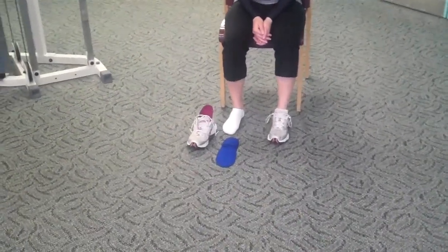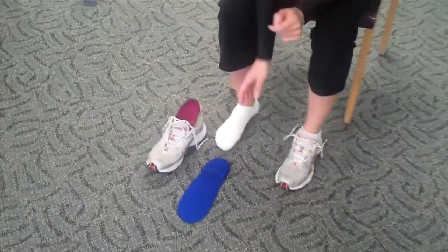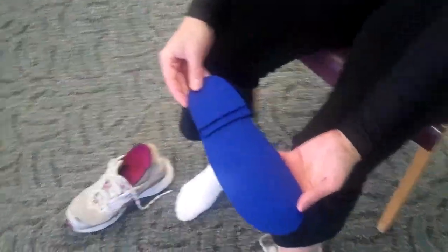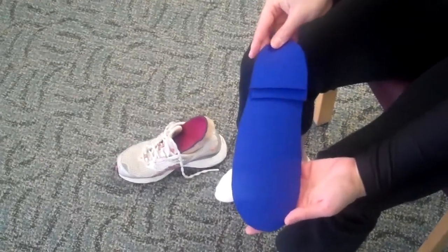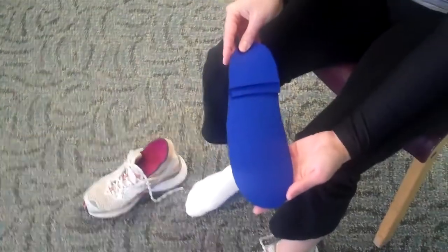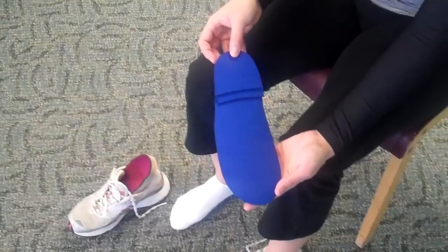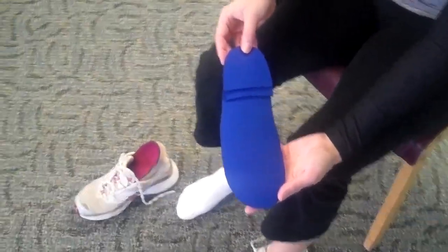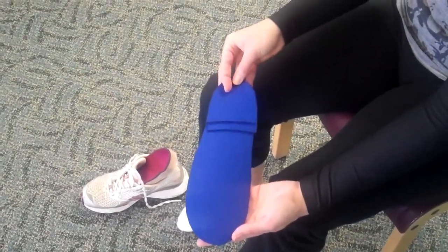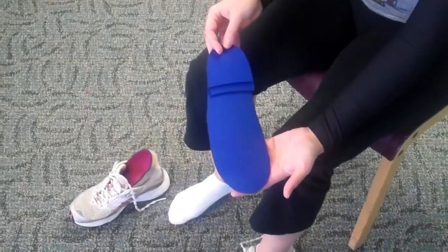And now we're going to show how that treatment can be advanced. In this case, Liz has some Spenco inserts, which can be layered. Spenco is one of the best products for shock absorption. In a scenario like knee pain, knee arthritis, hip arthritis, stress fractures — any shock absorption issue — you can layer Spenco to develop a good shock layer to fight against the forces that come with impact.